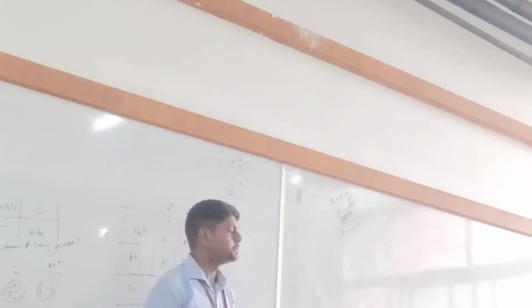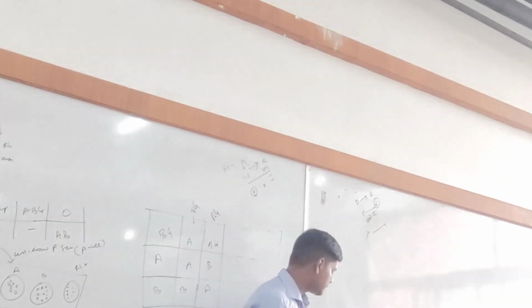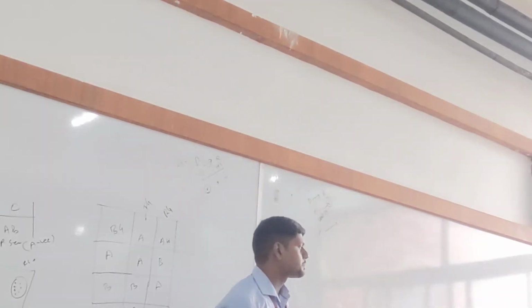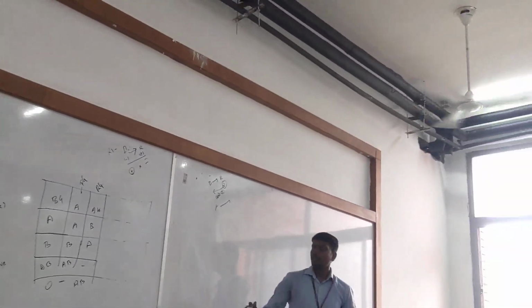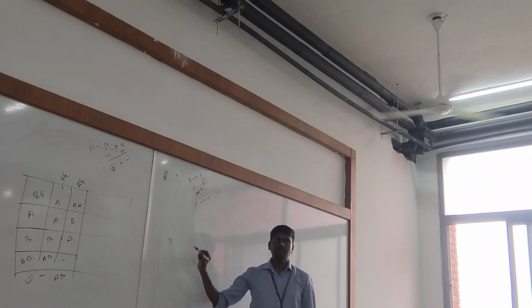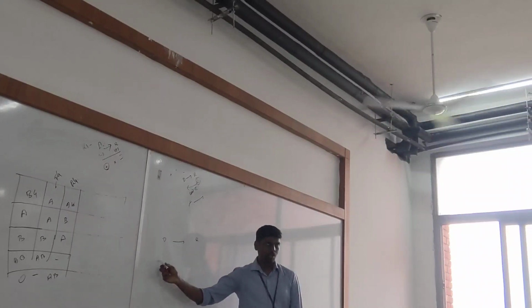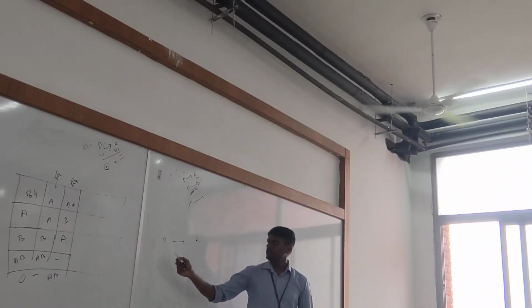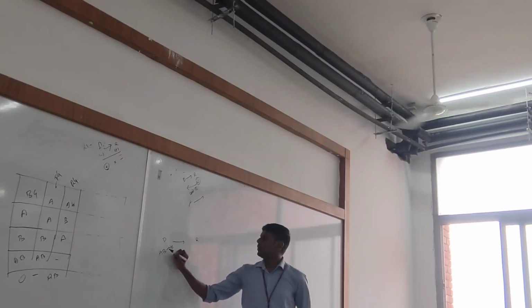Now listen, I will give you one case study. The case study goes like this. So, I have a donor and I have a recipient. I did blood grouping for the donor and I came to know that the donor was AB negative.